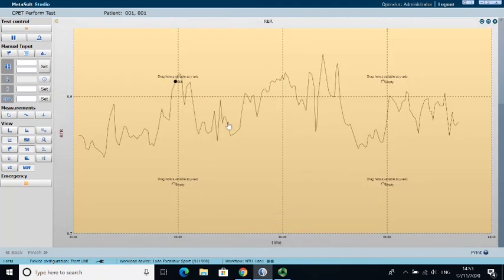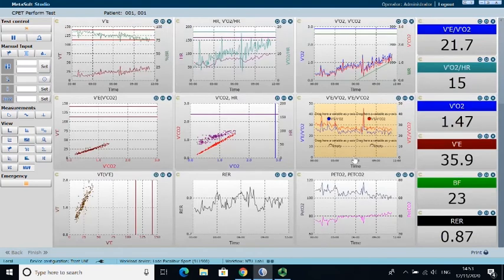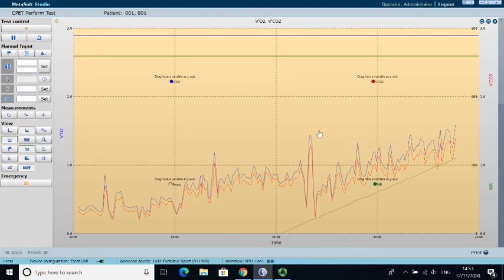Okay, so then this is that RER again that I just talked about. It's not the nicest plot in the world, it's going a bit up and a bit down, but it's sitting at around 0.8 or 0.9, which is completely reasonable for rest and low level exercise. And then now I'm taking you back to this block so you can see what I've just tried to explain in a little bit more detail.